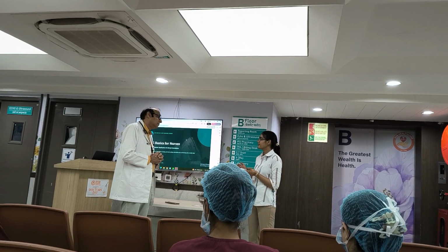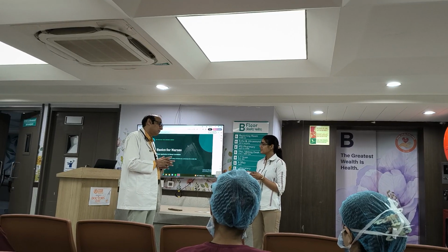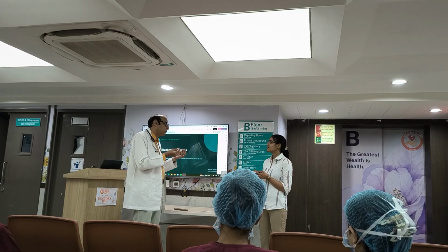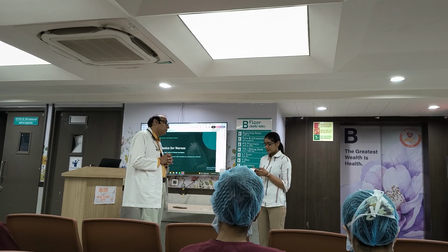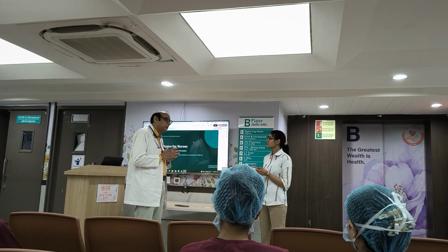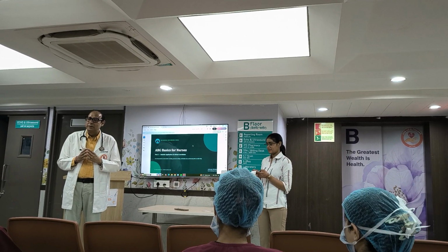जो बॉडी में ब्लड है. Okay, and after that what is the next? PCO2, partial pressure of carbon dioxide. What is the normal limit? 35 से 45. ये क्या चीज़ है? ब्लड के अंदर पार्शियल प्रेशर ऑफ CO2, ये बताता है कि ब्लड में कितना CO2 है. Right, next. PO2 36. Normal PO2, anyone please? What is the meaning of PO2?